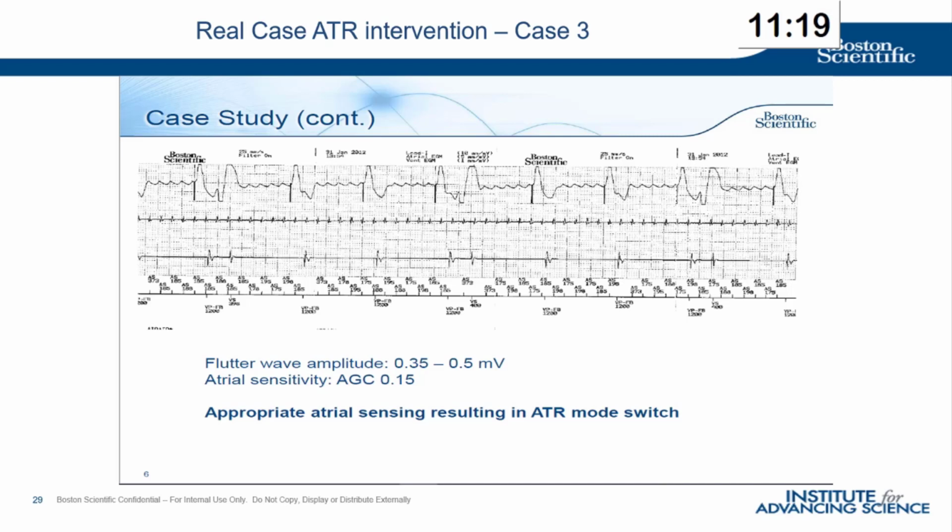So this was a case where in the beginning the pacemaker couldn't see all atrial events. It took time for us to mode switch due to this sensing problem. Therefore, it's so important to link all these features with the very basic things that we do on a daily basis during our follow-up. For example, sensing, pacing. As you know, undersensing means overpacing. Oversensing means underpacing. So all of these will also be affecting the complex features that we have, knowing that we are going through different phases to reach the mode switch. It's not only, like other manufacturers, just talking about the counters itself, for about 3 seconds or 2.5 seconds. It's all about duration, entry counters, exit counters as well.